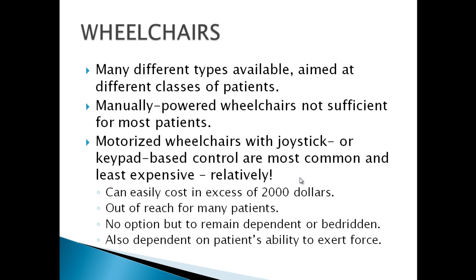Even though they are said to be the most inexpensive type of wheelchairs other than the manually powered ones, they could still easily cost in excess of $2,000, and a lot of patients, particularly in third world countries, may not be able to afford them.